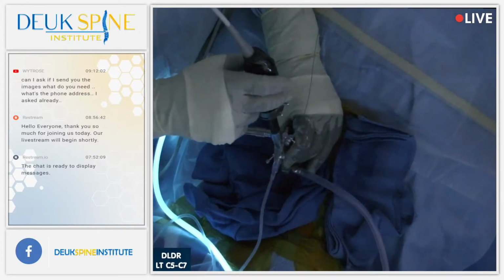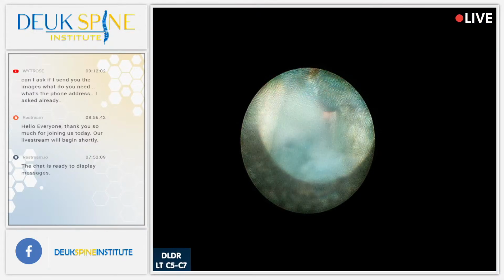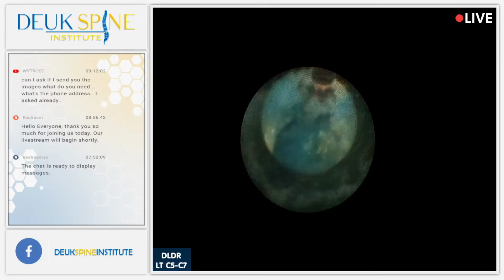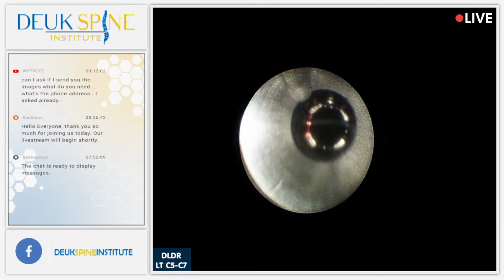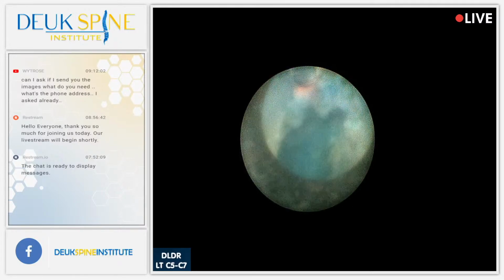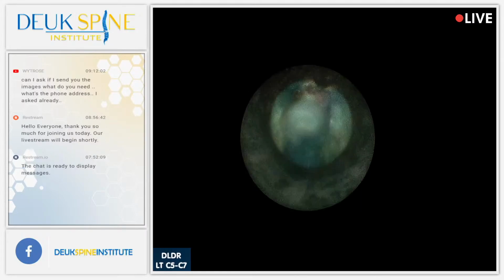After 1 year of surgery, the average amount of thoracic pain relief was 99% of axial pain. Each of those are pieces of herniation there. The irrigation is nice and cold, folks. Nice job. The average amount of radicular symptom relief, thoracic radiculopathy, was 96%.